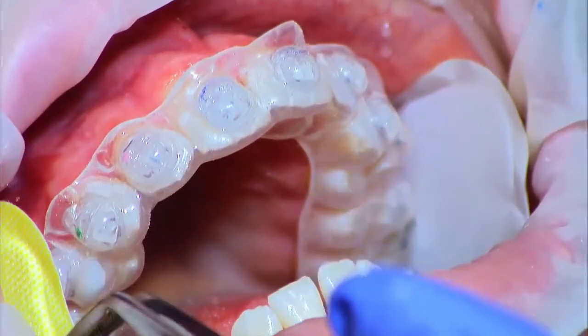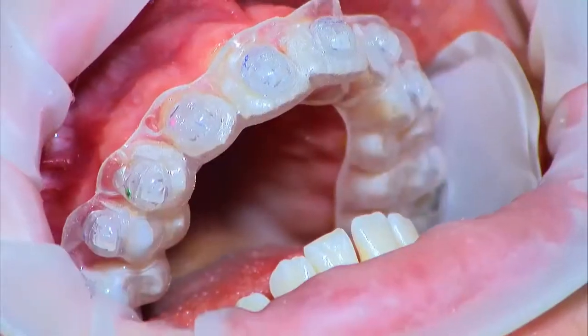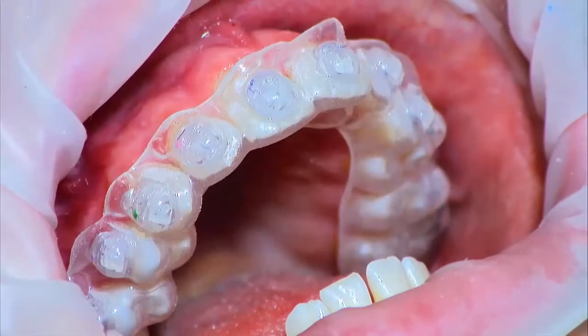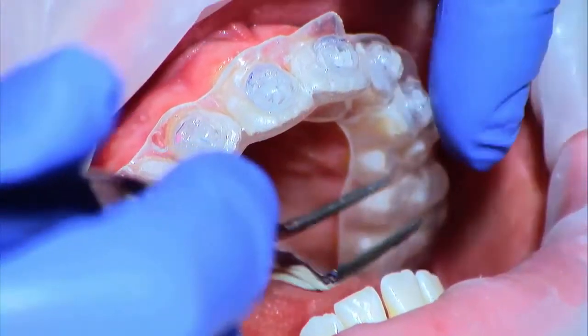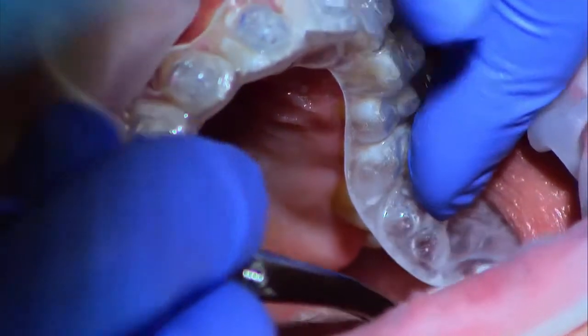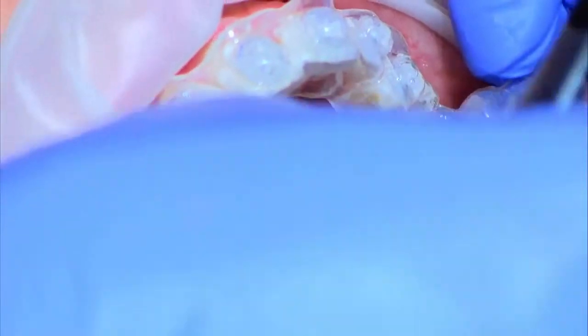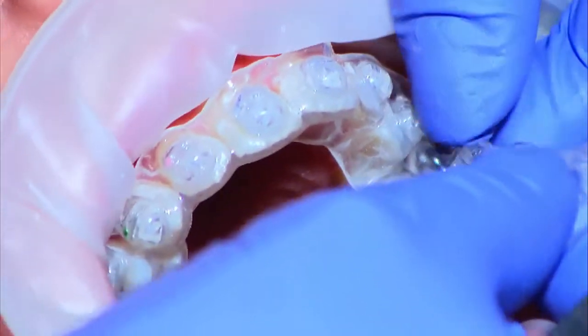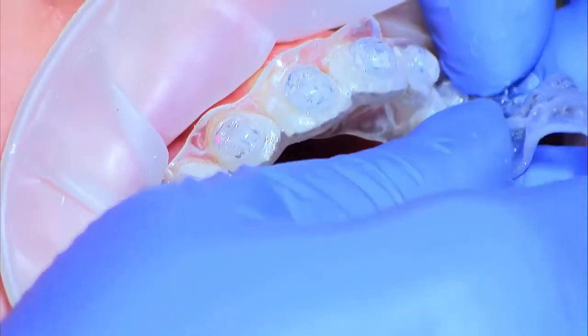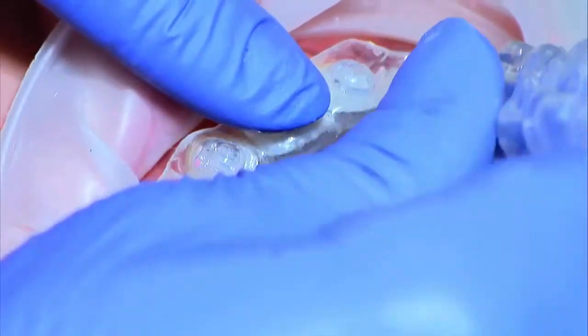At this point, remove the dry angles from the patient's mouth. If needed, use water from the air-water syringe to loosen them. When curing is done, gently pull on the lingual side in the back to remove the soft tray. Peel the tray along the incisal edges of the teeth, keeping equal force on the buccal and lingual sides. Don't pull too hard, but use an adequate amount of pressure.